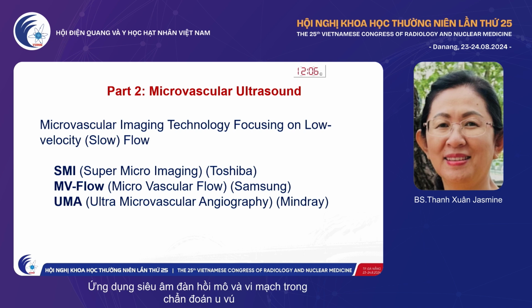Now, I want to show you the second part, which is microvascular ultrasound in diagnosing breast tumor. As you know, Professor Wong also talked with us about microvascular ultrasound, so I would like to show you something about that a little bit.